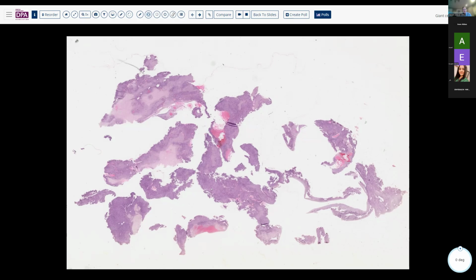And of course, a metaepiphyseal lesion in a 19-year-old is going to have a fairly limited differential diagnosis. You're going to be thinking about things like giant cell tumor, maybe a chondromyxoid fibroma, maybe a chondroblastoma, although usually those don't cross the growth plate. And then also possibly, obviously, an osteosarcoma comes into that differential as well.